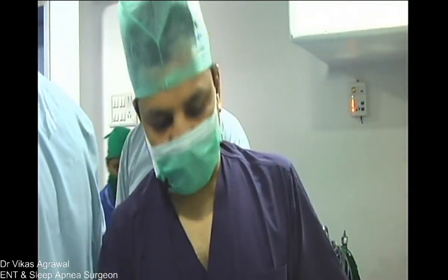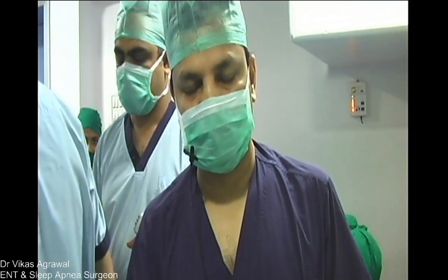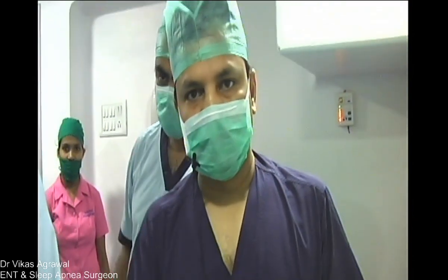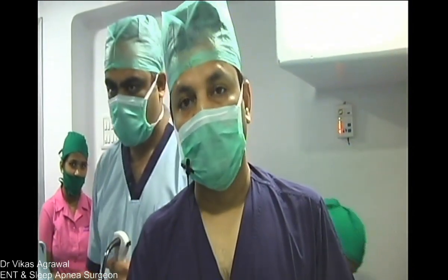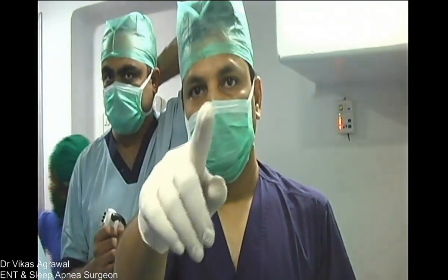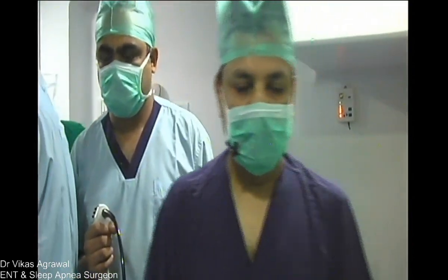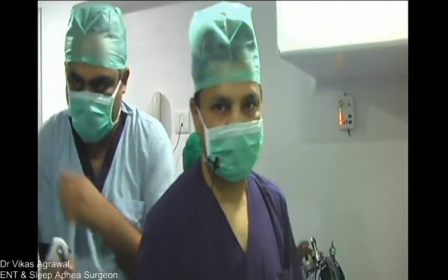So, what is drug-induced sleep endoscopy? As we understand that in sleep apnea there are two types of obstruction. One is static, the other is dynamic. Now, static obstruction we can understand easily when the patient is awake, but for dynamic obstruction we have to take the patient under sleep. Then only we can, unless we induce the patient into sleep, we cannot assess.